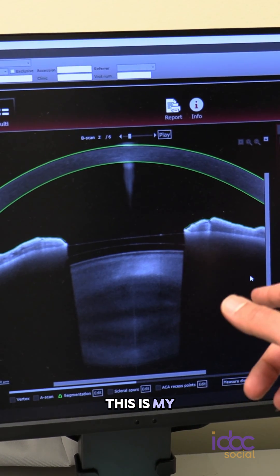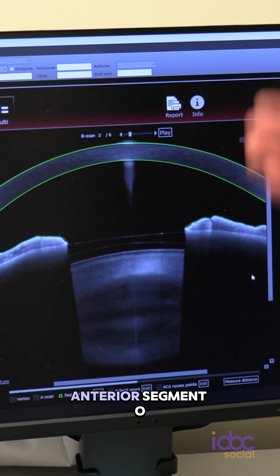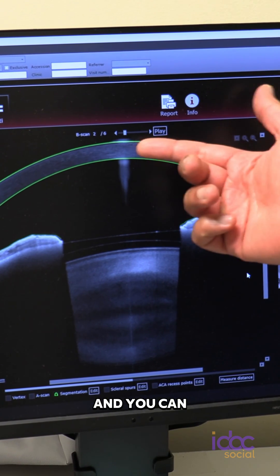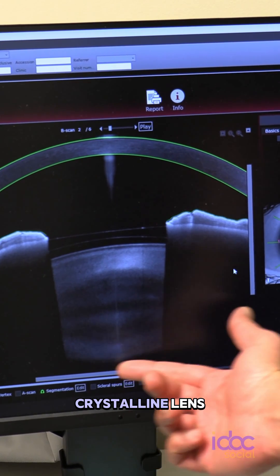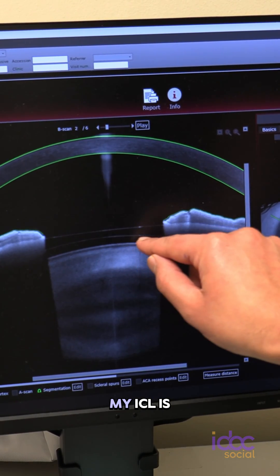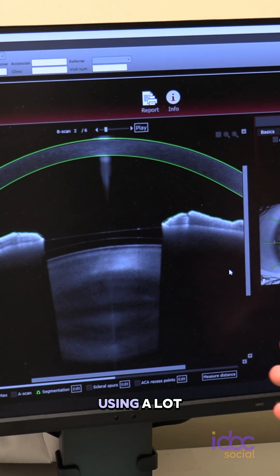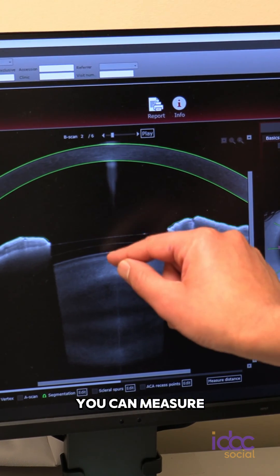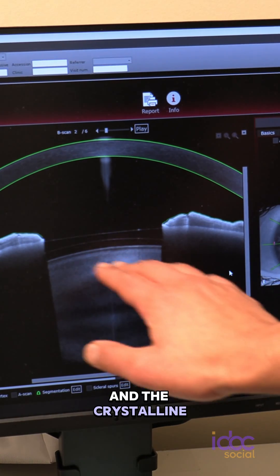This is my right eye using the Heidelberg Anterion Imaging Anterior Segment OCT. You can see my cornea all the way down to the back surface of my crystalline lens. And if you notice, here is where my ICL is located. Using the tools that this software has, you can measure the distance between the ICL and the crystalline lens.